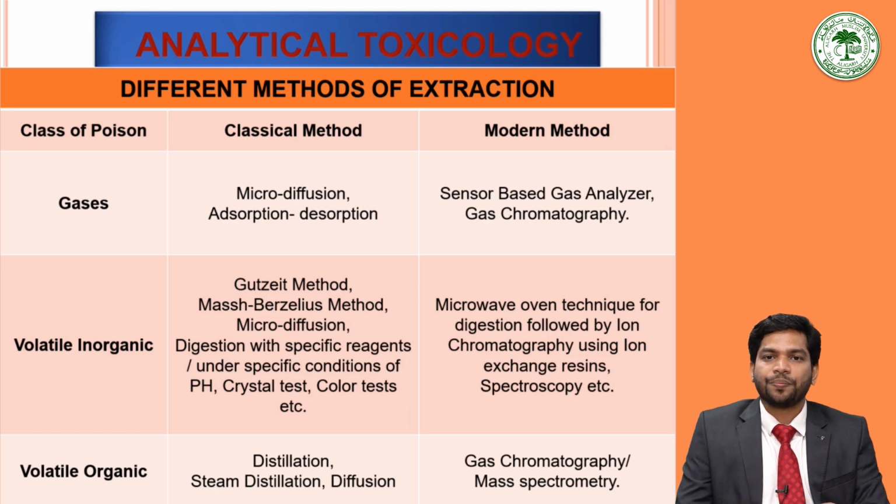The selection of proper extraction methods depends on various controlling factors like the nature of the poison, the matrix or matrices, and also the quantity of sample available or forwarded for the analysis. The active constituent should be extracted from the sample in minimum steps to avoid loss during the processing. The extracted material also requires proper stripping or purification to avoid interference of matrices as far as possible.